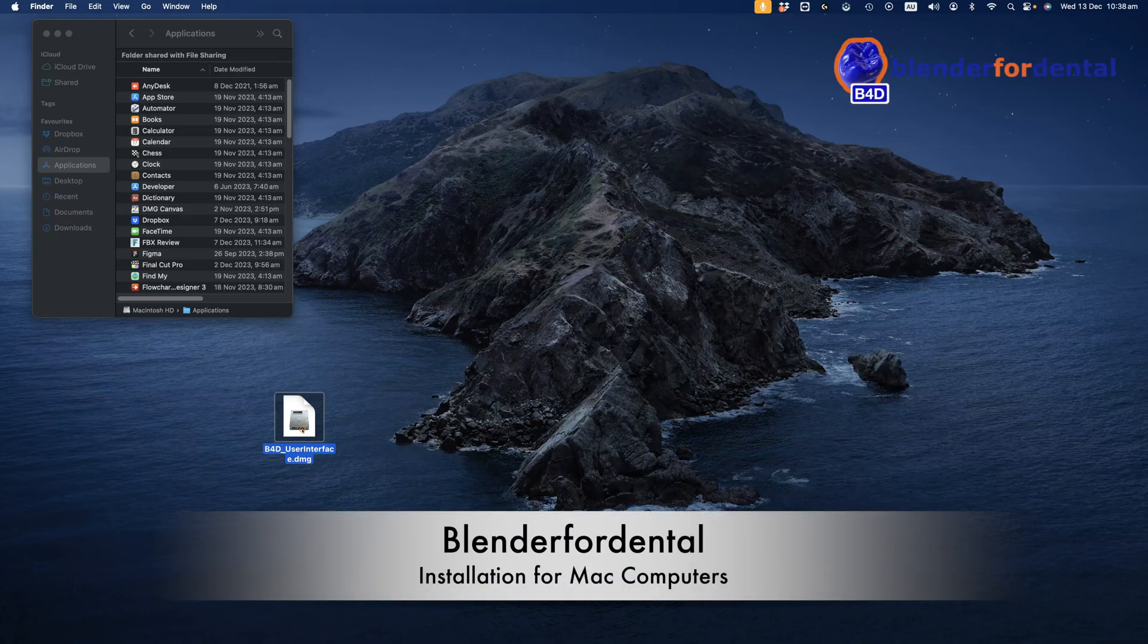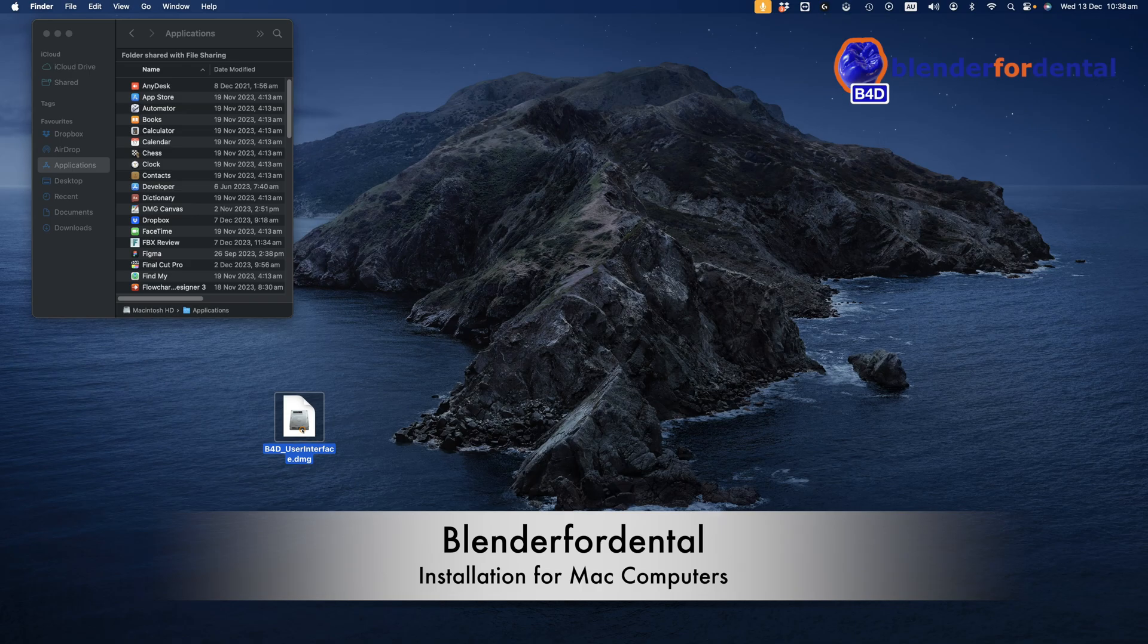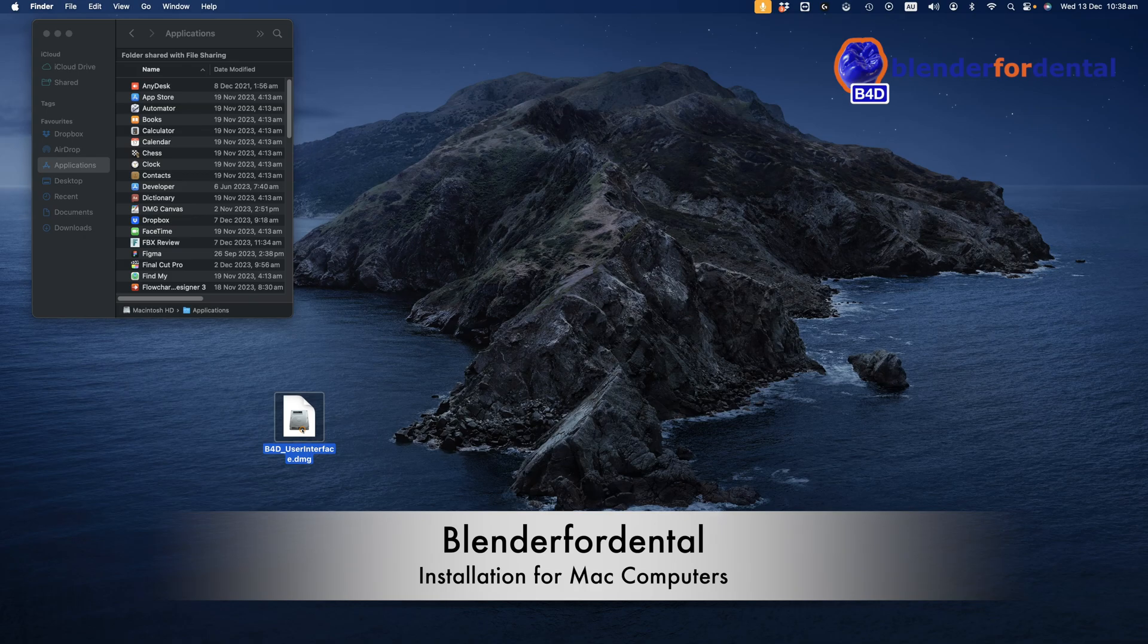Welcome to Blender4Dental. In this video we'll guide you through the installation of the software. To get started with Blender4Dental, download the user interface from the How to Install B4D webpage on the website.